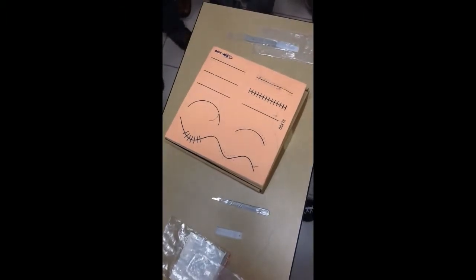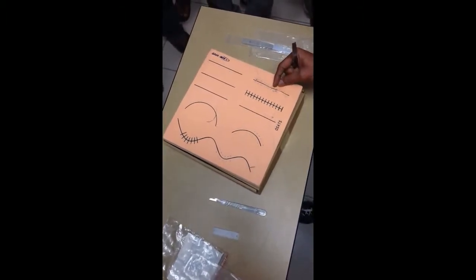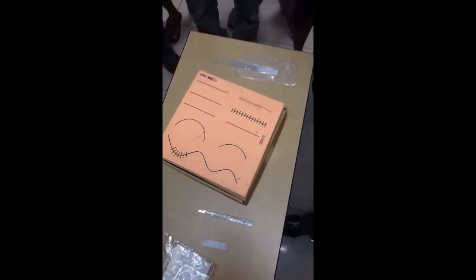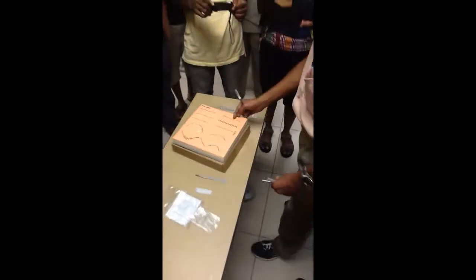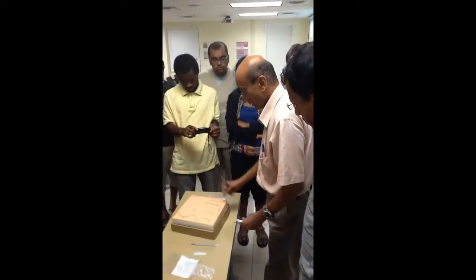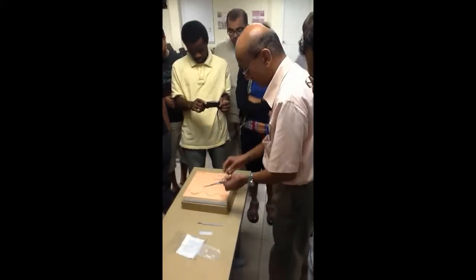This is the procedure for doing a continuous suture of the linea alba, which was shown here — they showed only the first two steps, and this is how we complete it. So now all of you start practicing.